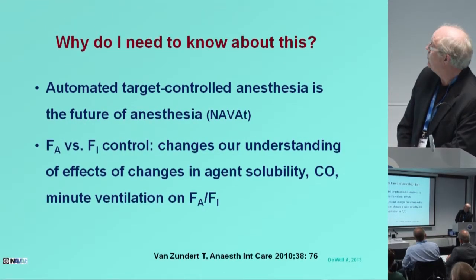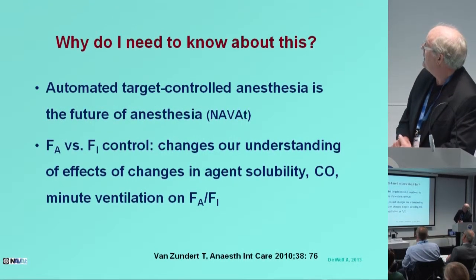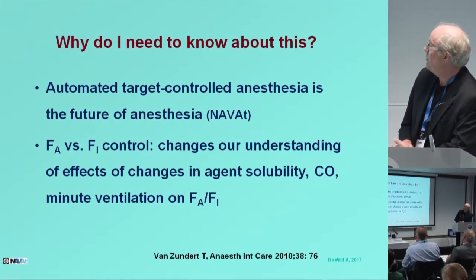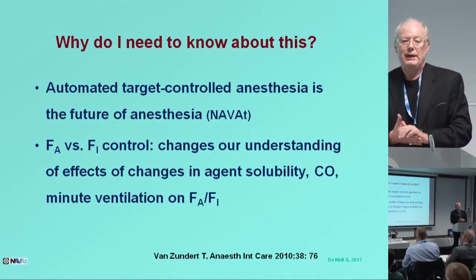So why do I need to know about this? I think that automated target controlled anesthesia is the future of anesthesia. We'll go in that direction, whether we want it or not. This will happen. But it also changes our mind. We have all learned about the FA-FI curves from Ted Eger and how they rise and what the effect is of cardiac output and minute ventilation on the rise of these curves. If we use FA control, these curves are out the window. They are not valid anymore. And that is very well described in a study that we did using Gasman that Tom van Zundert published.